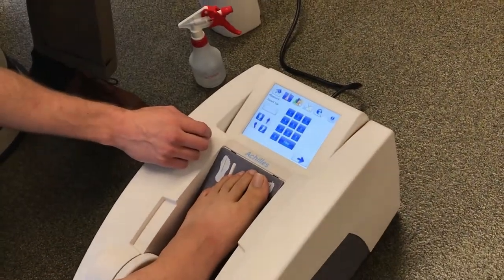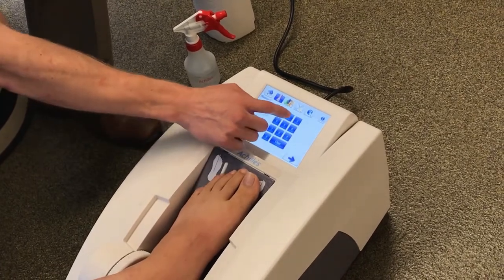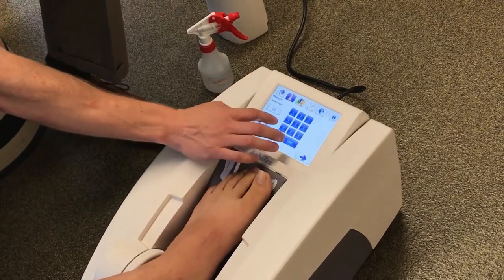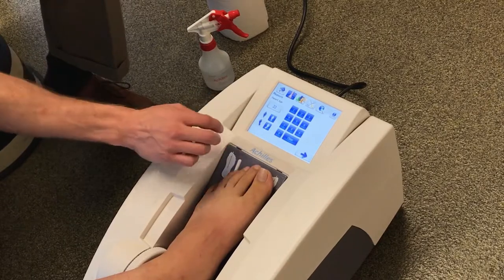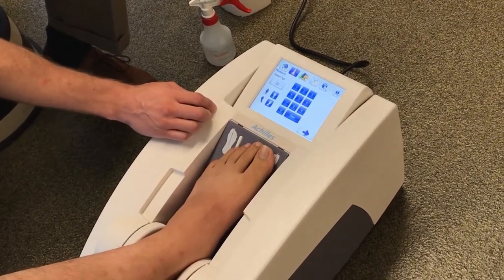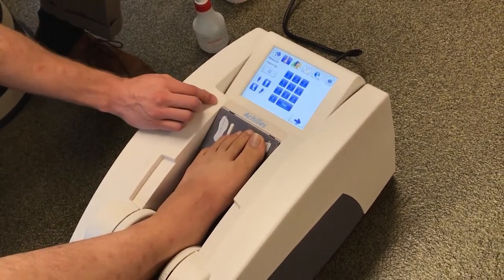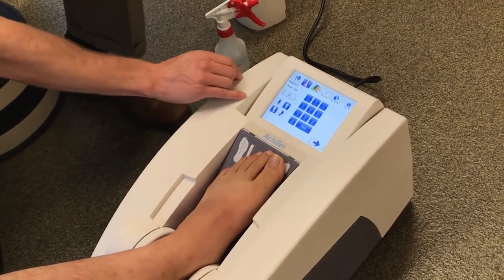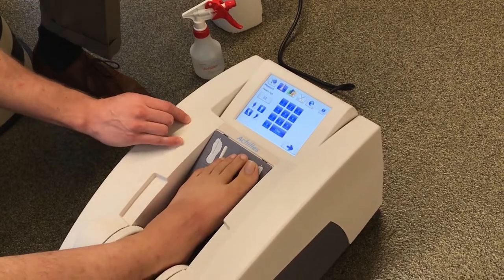First we'll ask the patient their age — 22. Then we'll indicate the gender: on the left is the female button and on the right is the male button, so let's touch male. Then we need to indicate which foot, left or right. Since we're doing the patient's left foot, click the left foot button. Double-check the age, gender, and correct foot. That's really all the information we need to put in, so now we can hit the right arrow and go forward.